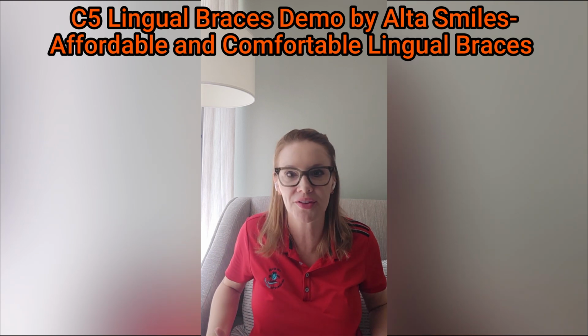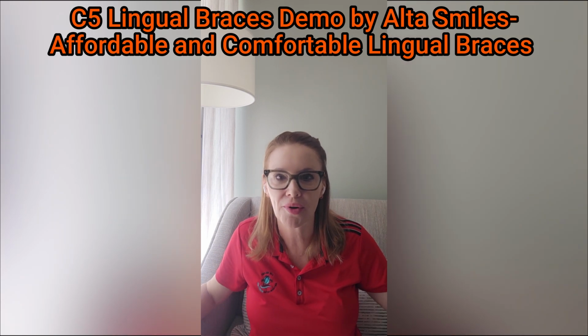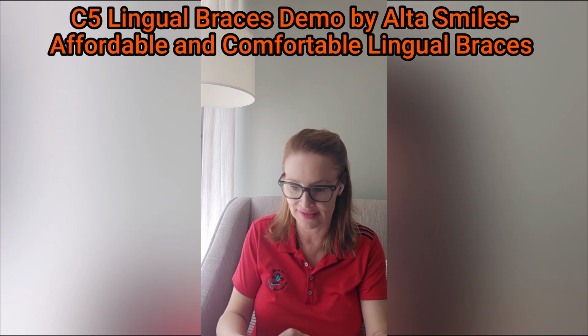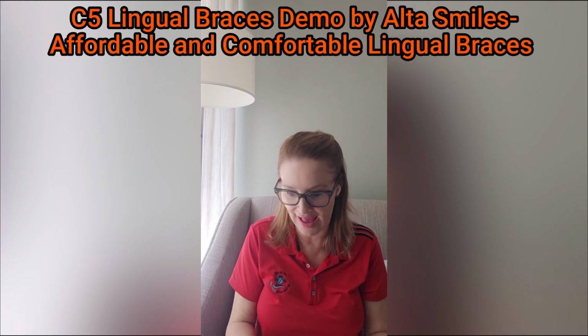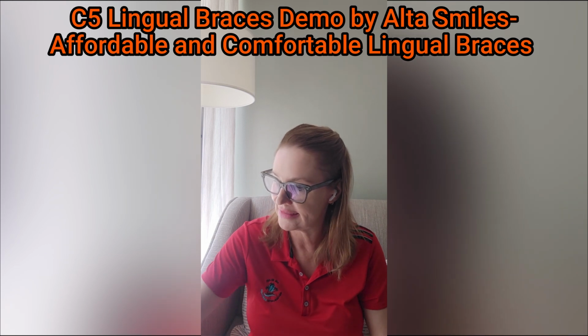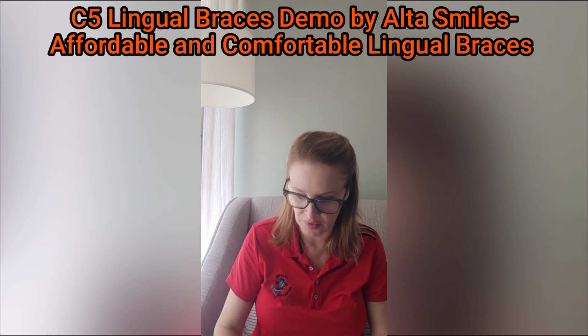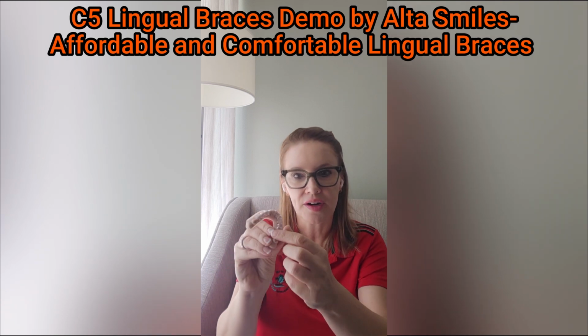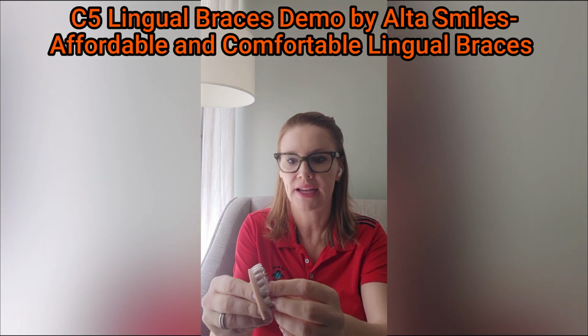So think about how much cheaper this would be because you don't have to buy any brackets. All you do is just throw the little tray on, and that is basically done. And they have people that basically set this up for you, and they make sure the wire's in the right spot and it's stabilized. There's like an indirect bonding tray, not unlike an attachment template.